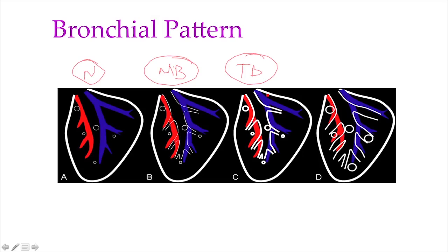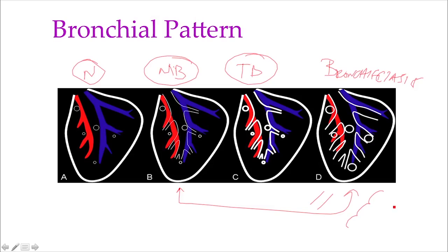We can also have bronchiectasis, in which case the bronchi don't taper towards the periphery. Comparing mineralized bronchi — where we can see the bronchial walls — with bronchiectasis: in bronchiectasis the bronchi appear to stay parallel or become saccular, while in normal bronchi they become thinner towards the periphery. When we see bronchial thickening, we think abnormal bronchial pattern; when we see mineralized bronchi with thin walls, we consider it an age-related change.